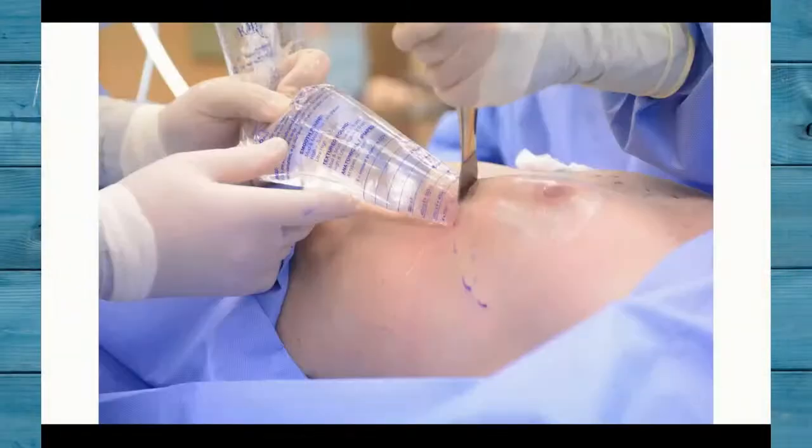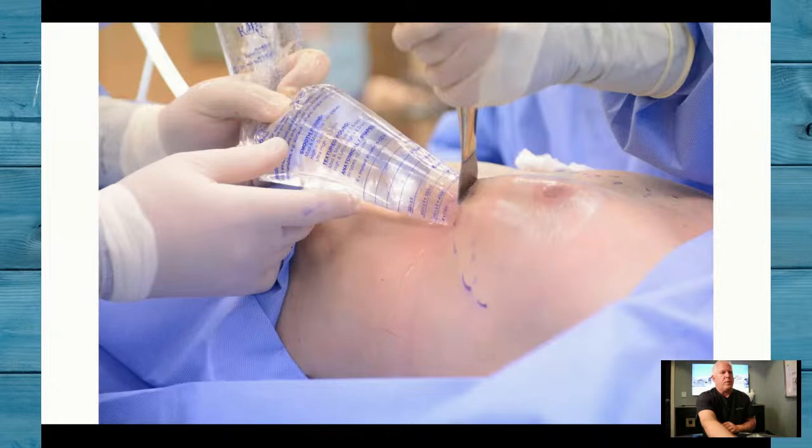And when we pop up the PowerPoint here, this is just an image of a 1-inch incision. And so we do a no-touch technique where we take the implant out of the box, it goes directly without touching the implant into this Keller funnel, which is a lubricated funnel that allows us to push a larger implant through a smaller incision without being contaminated from the skin, because the #1 area of contamination is either from the breast pocket or actually from the skin. So we push this device through into the pocket that's been precisely created for your specific implant. By the way, my scrub tech calls this the funnel of love. And so you can kind of contemplate that, I guess, a little bit.